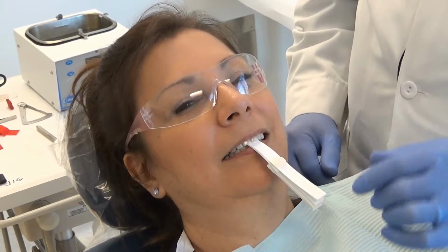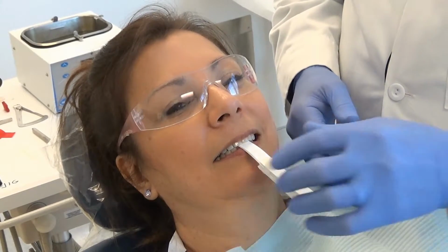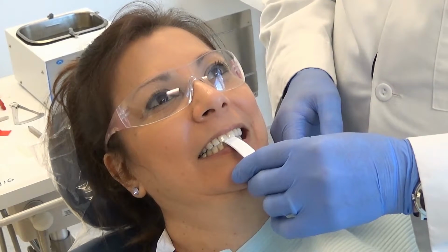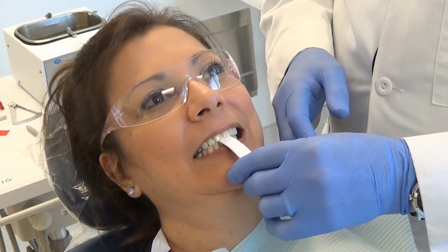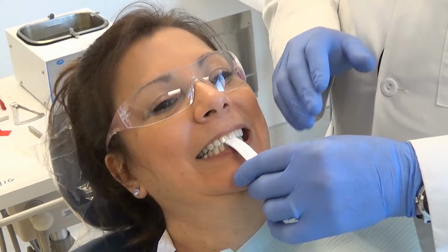What you want to do when you're doing this technique, this is an awesome technique to check something. And what you want to check is, open and stay open, please. You want to take one leaf away at a time until the patient can feel something touch in the back. And that very first point of contact that they feel, you're going to ask them where they feel it. And they can use their finger to point left or right side of their mouth.